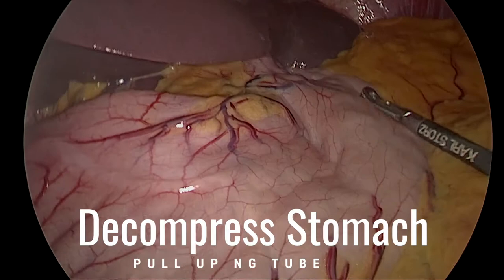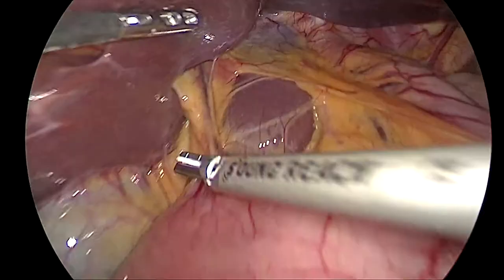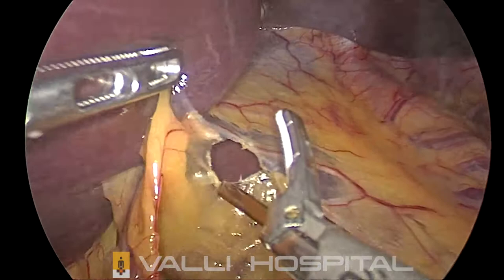After diagnostic laparoscopy, the first step you have to do is the decompression of the stomach. Put in a Ryle's tube, aspirate nicely, then remove the Ryle's tube. Don't remove it, you keep it in the stomach. You should not keep the Ryle's tube in the esophagus, because the chance of injuring the esophagus is more if you keep the Ryle's tube in the esophagus.